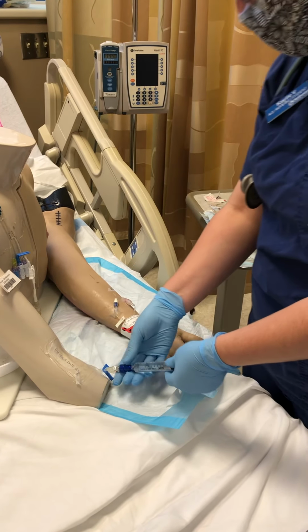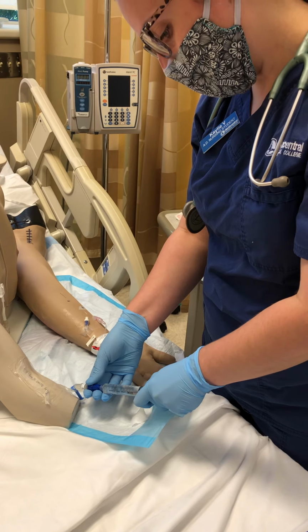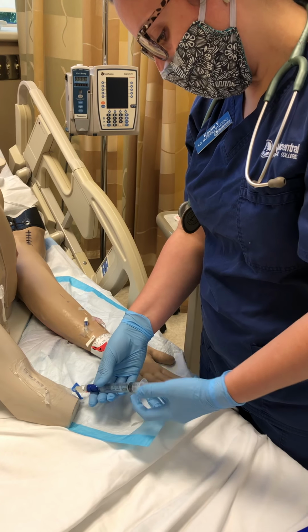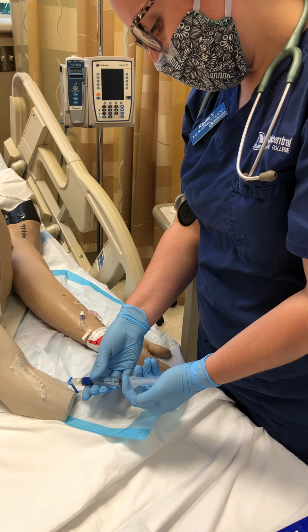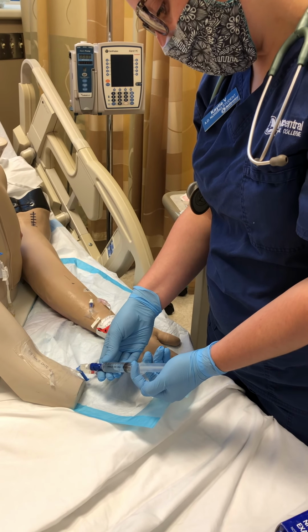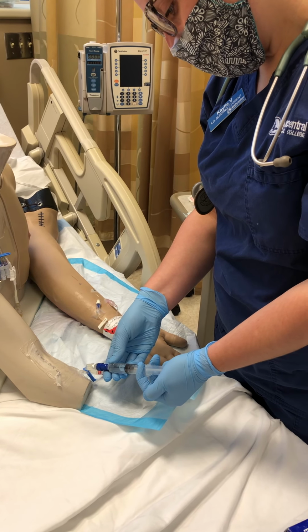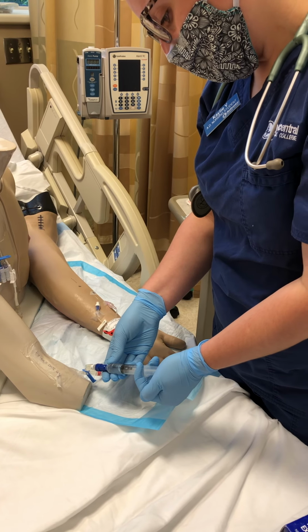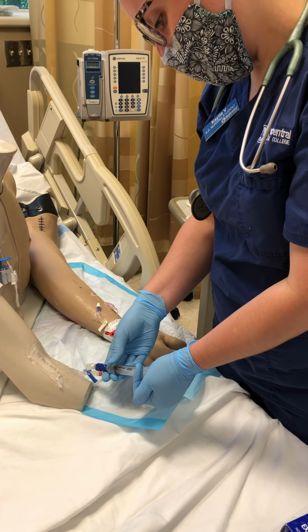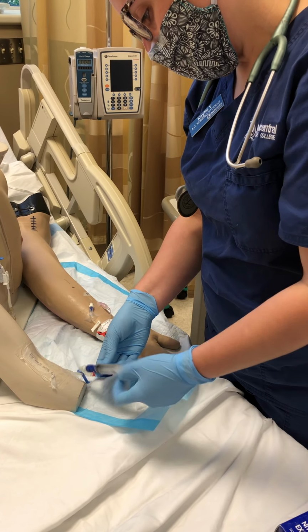And I know that this is an appropriate gauge needle. Catheter, I mean, I've been giving him drugs through this catheter all day. I'm monitoring the site to make sure it's running nice and clean. Watching the clock on the wall. Perfect.